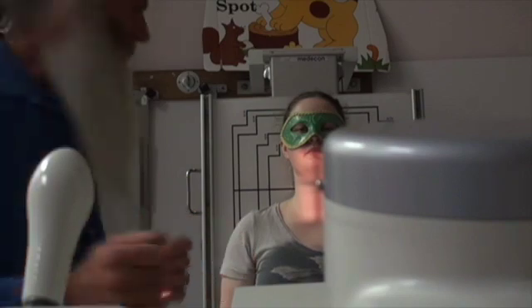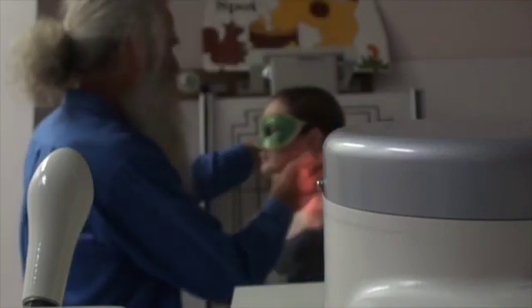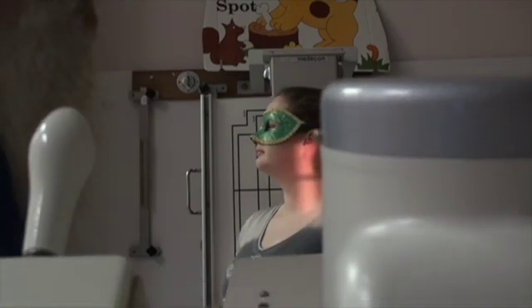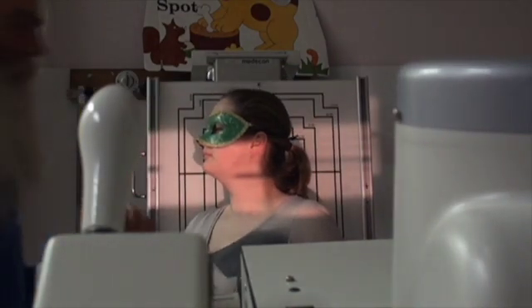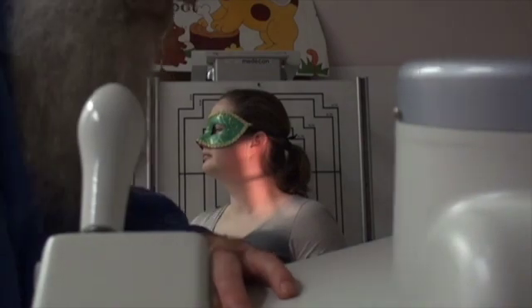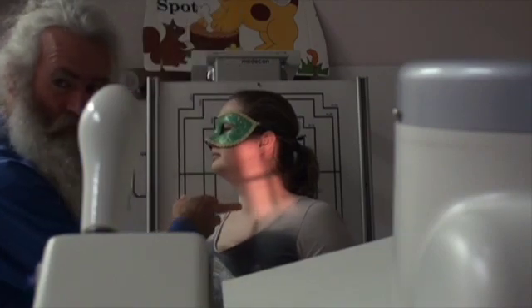Now let's go straight into our obliques. The tube is still in its position at 15 degrees arc, so let's turn the patient to 45 degrees with the shoulders, head around, chin up. We adjust the height slightly, work out our collimation, grab the film. Collimation goes just above the ear hole, then we move the patient back a tiny bit so that we don't expose the thyroid to the primary beam. That's about the right angle — 45 degrees with the shoulders.